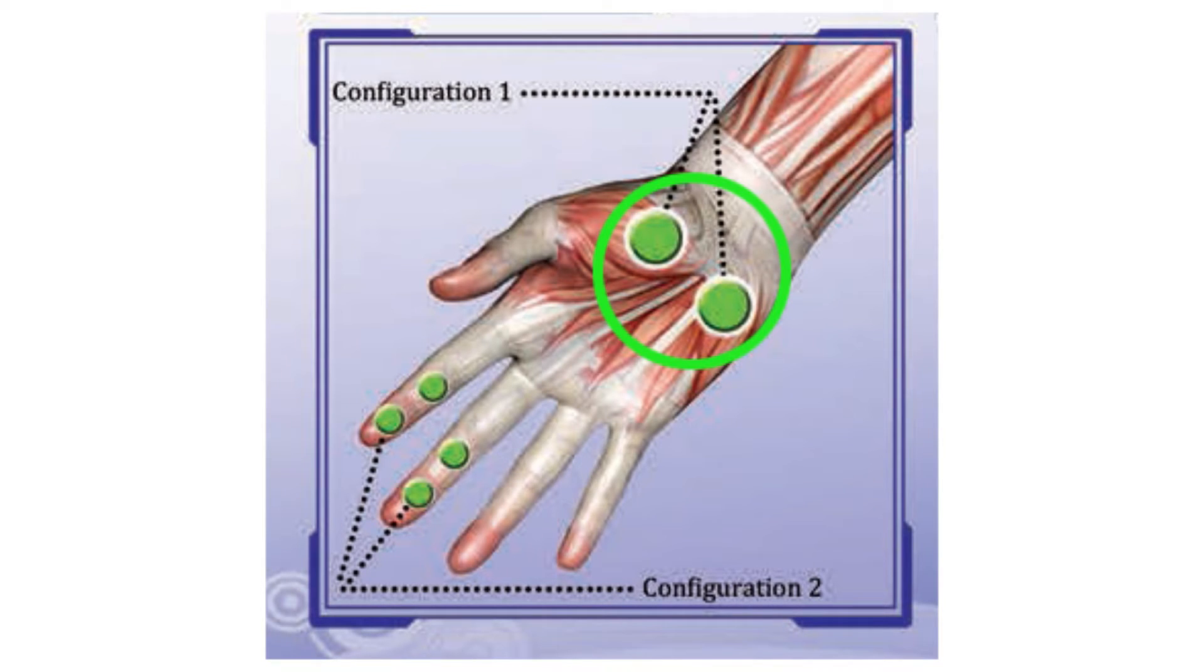We're going to use two GSC electrodes and place them on the subject's palms, specifically on the thenar and hypothenar eminence, to record fluctuations in skin conductance.